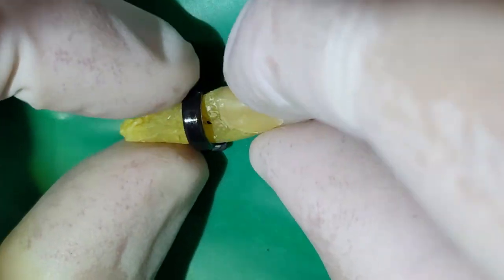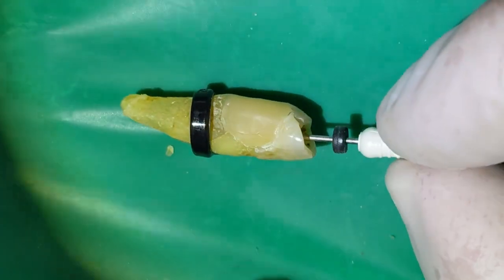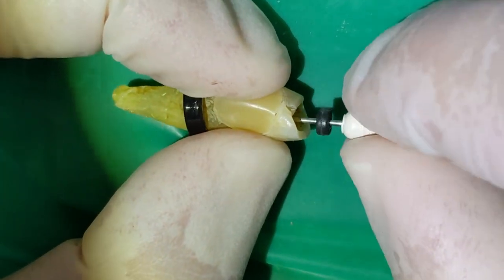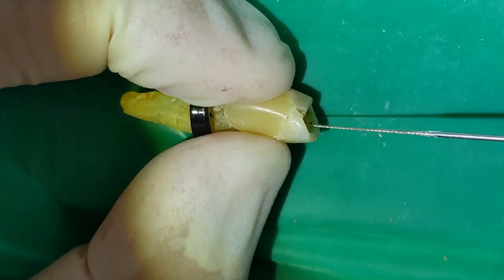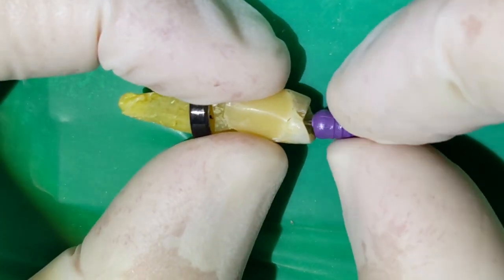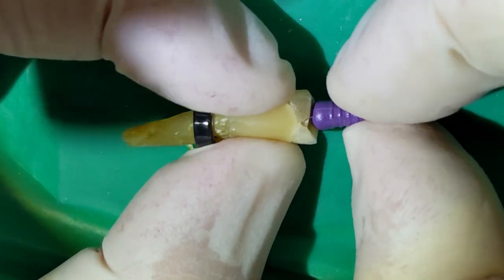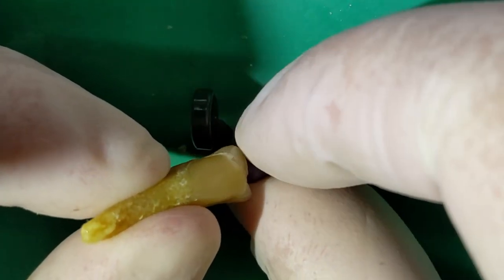Spin this around so maybe you can see a little bit better. Should be close to the apex. Let's see if we can see it coming out. Where's the apex? See it anywhere there? I think that's the apex right at the root tip.